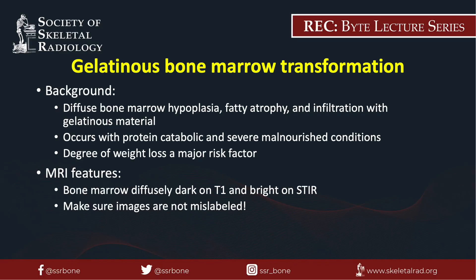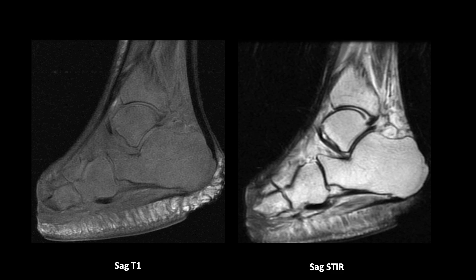Gelatinous bone marrow transformation, or serous atrophy of the bone marrow, is a phenomenon in which the bone marrow becomes hypoplastic and undergoes infiltration with gelatinous material. Risk factors include severe protein catabolic and malnourished states, for example in patients with anorexia, AIDS, long-standing alcohol use, and severe systemic illness. On MRI, the bone marrow appears diffusely hypointense on T1-weighted sequences and hyperintense on STIR sequences — the extent of abnormality is so extensive that the T1 sequence looks like a STIR sequence and vice versa. Here's an ankle MRI of a patient with severe malnutrition demonstrating this exact opposite appearance of normal bone marrow.